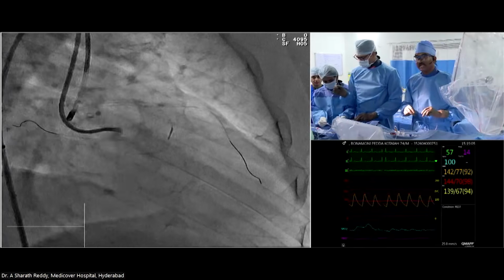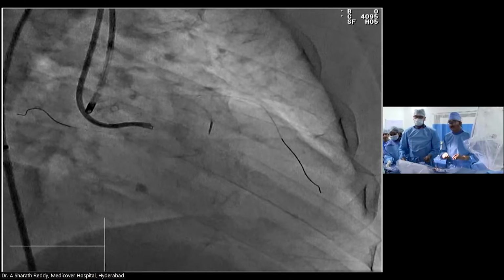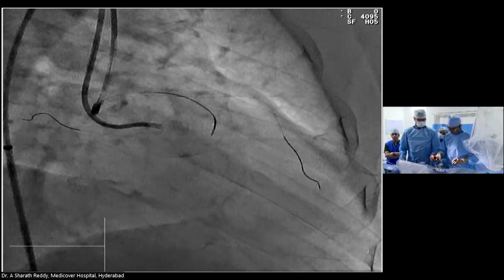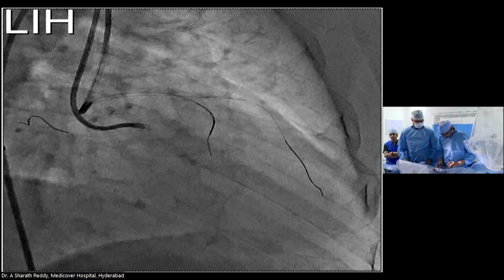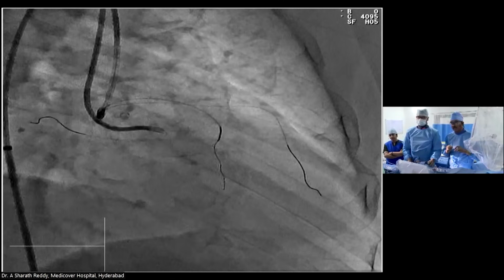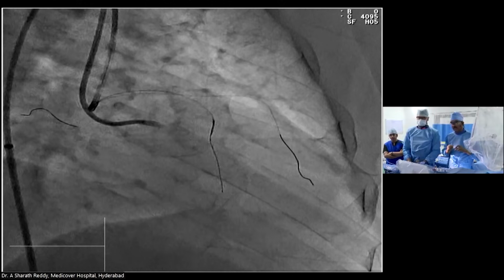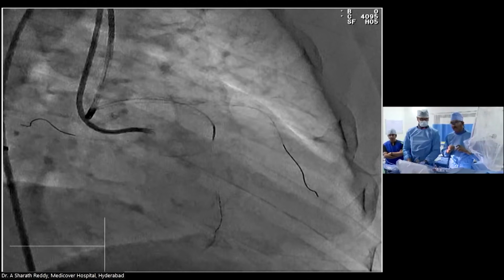So my reference is the same view, right? Yeah, the selective injection reveals that the vessel is often more tortuous than in the overview. So it's getting more challenging, but the wire should take such turns. So comment on what you do. With a heartbeat, advancing the wire on the reference and through.